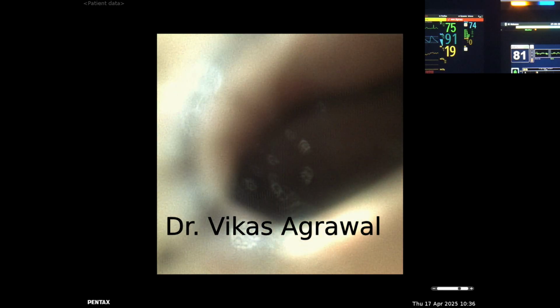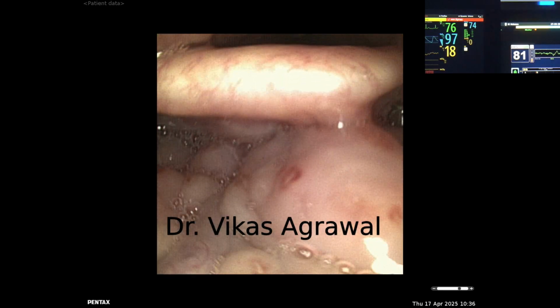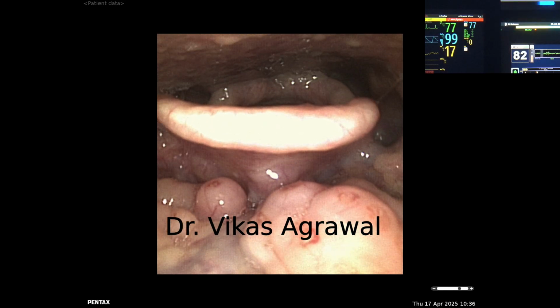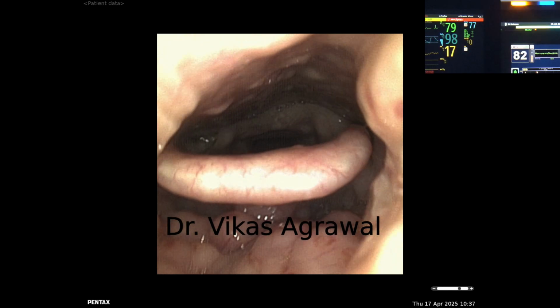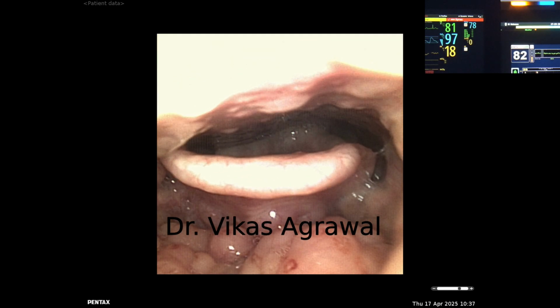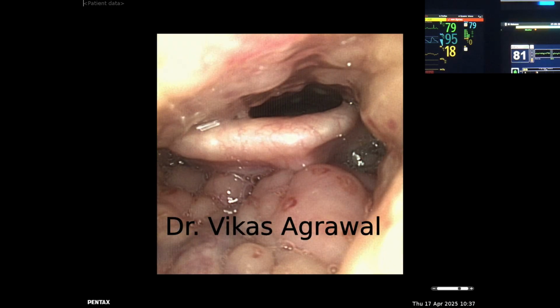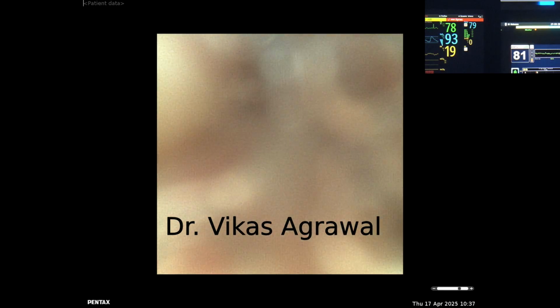There is some lymphoid tissue on the base tongue. So obviously he requires a uvulopalatopharyngoplasty with base tongue reduction and glossoepiglottopexy. As we can understand, an AHI of 66, majority apneas, could not have been only because of the nose, and therefore is referred from Indore. And his primary surgery would be palate surgery and base tongue and epiglottic surgery.